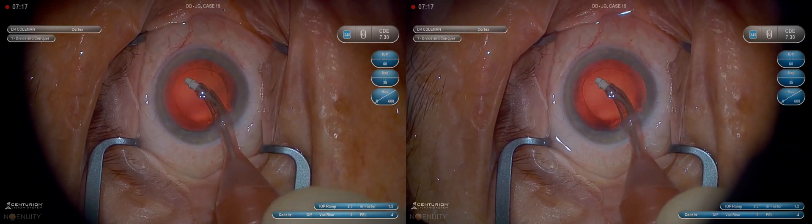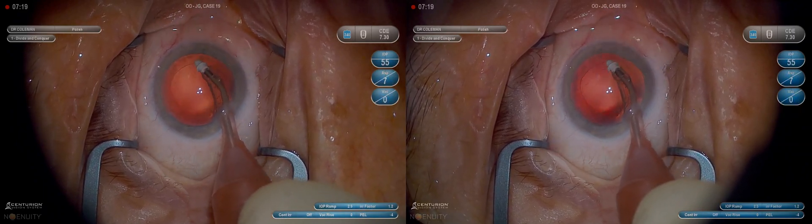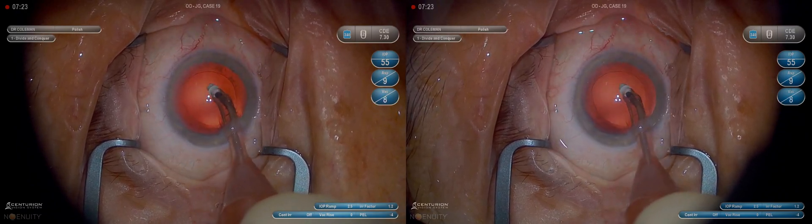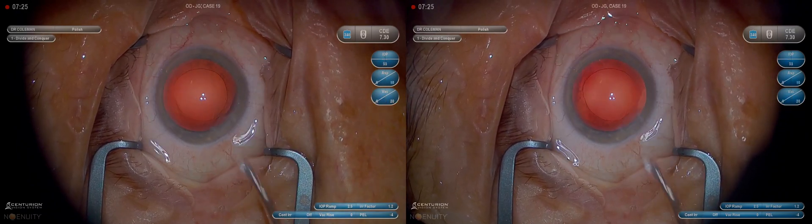We can polish a little if we need to. Polishing is really about contact and rubbing the surface of the posterior capsule more than it is about irrigation-aspiration, so we want to be very gentle on the foot pedal there.